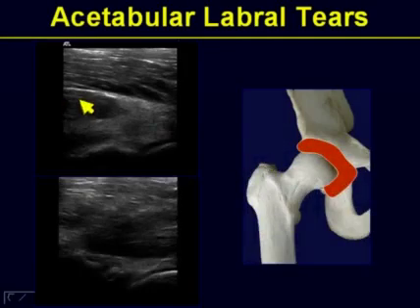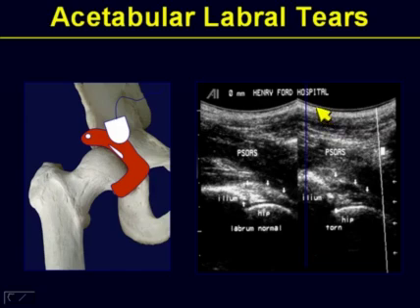It is interesting that we've seen the bone acoustic landmarks in this individual, the joint space or the joint line, and not only do we see them but also the acetabular labrum. So if you look on long axis and short axis view, you can identify the femoral heads and the acetabulum. In between them you see this hyperechoic triangle, both on long axis and short axis, of the acetabular labrum. This is going to be important nowadays because of the femoroacetabular impingement.